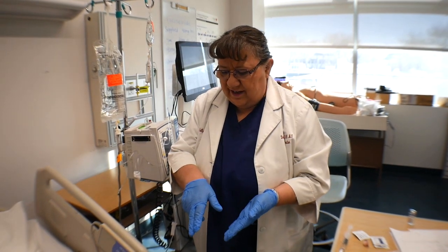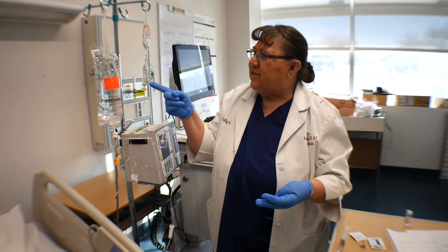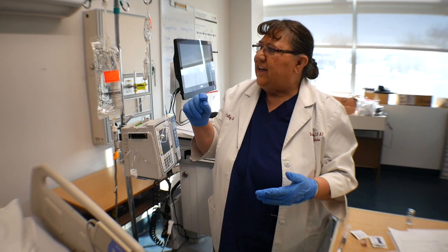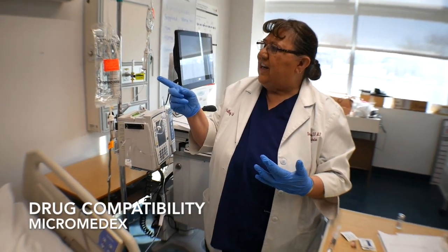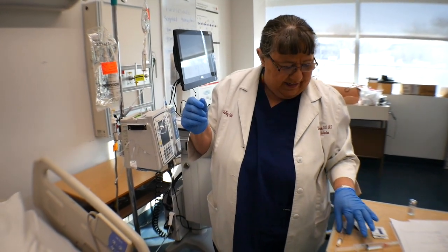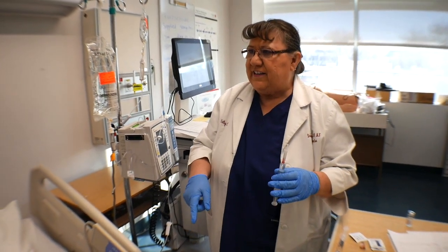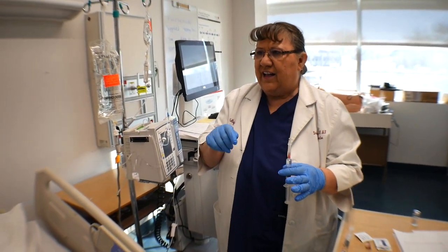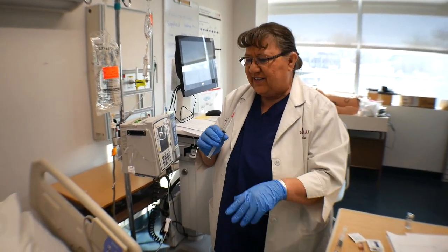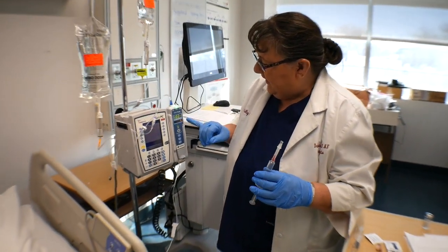So with the tubing, though, he already has IV fluids running, in this case it's normal saline. So with whatever medicine you're going to be giving, you need to check in Micromedex for compatibility between the solution that's hanging and the medication you're going to be giving, because you want to make sure that you can give it through the tubing. If it's incompatible, then you should use another line, or you need to flush it and maybe use the Y-site.